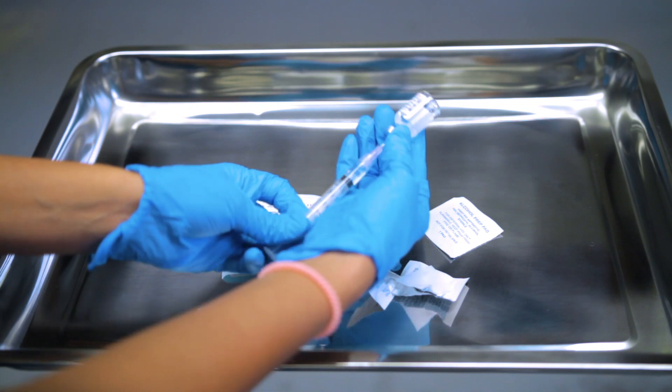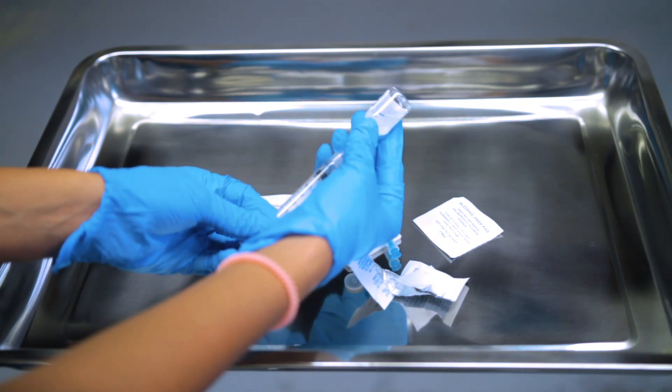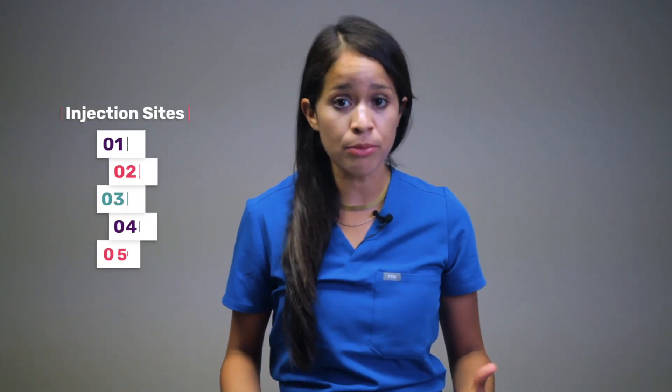For today, we'll be administering the flu vaccine. As I'm drawing up the medication, I'm thinking about what is the safest location to administer for the patient. The volume is 0.5 mL of medication to be instilled, so which muscle is large enough to store it? I'm also considering age and muscle mass.